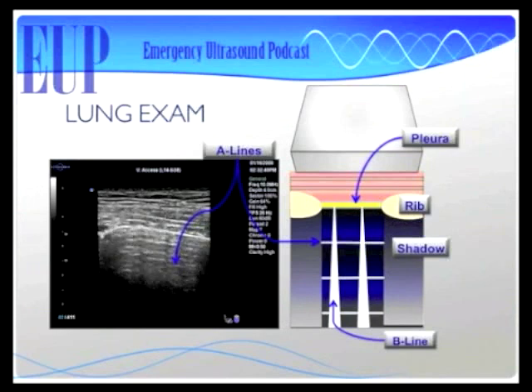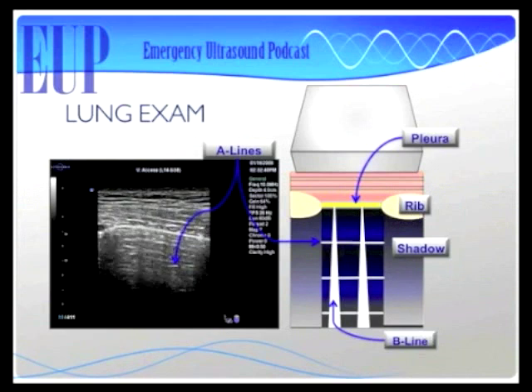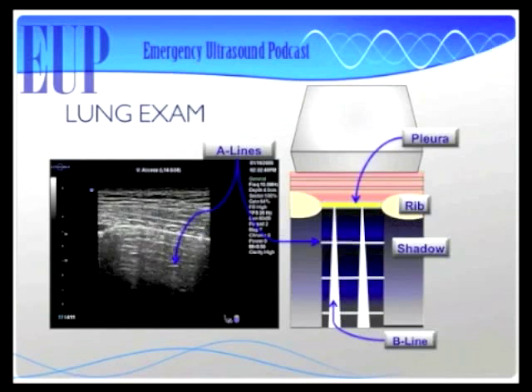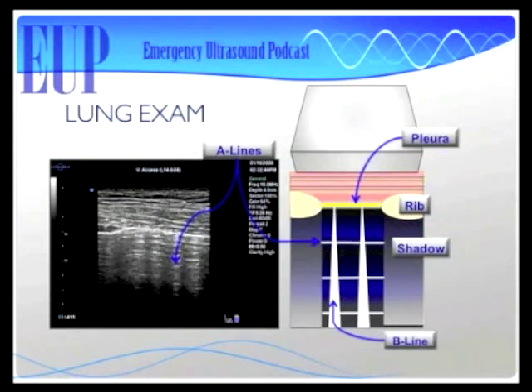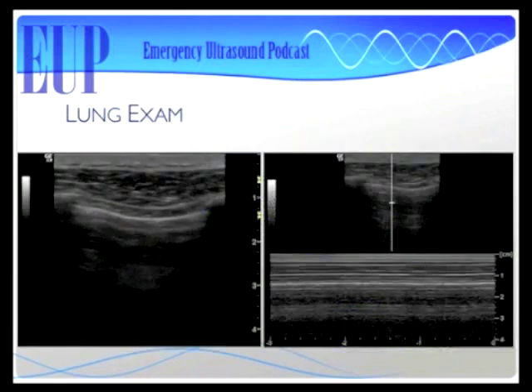When you look at the pleural line, you want to look for movement at the pleural line. We like to talk about ants marching. We like to talk about pleural sliding, but there's got to be some sort of change in the appearance of that line as the patient breathes. So you said, you may get to this, but you said B lines make me think there's edema. Yeah, but we'll talk about that in a minute. Okay. B lines are an artifact, and they signify edema.